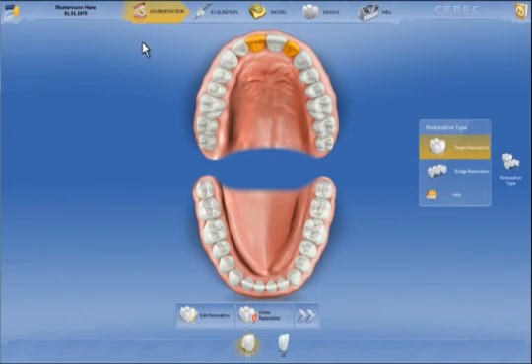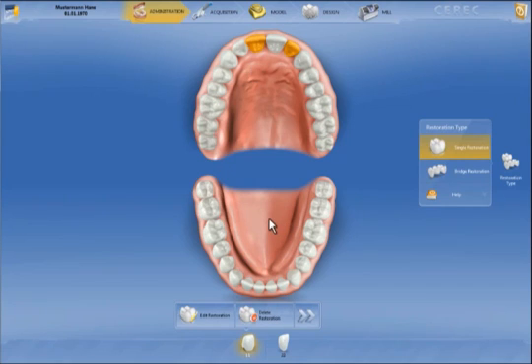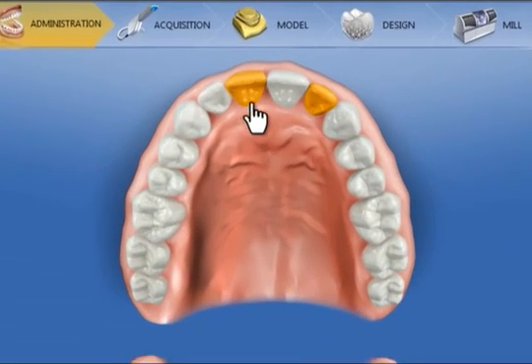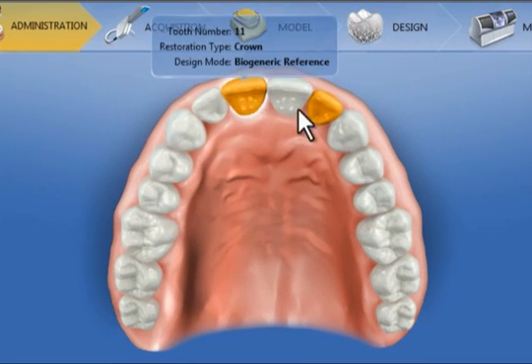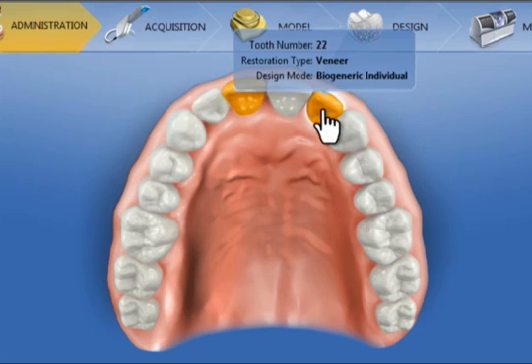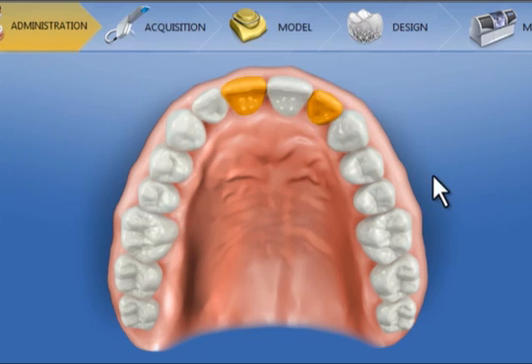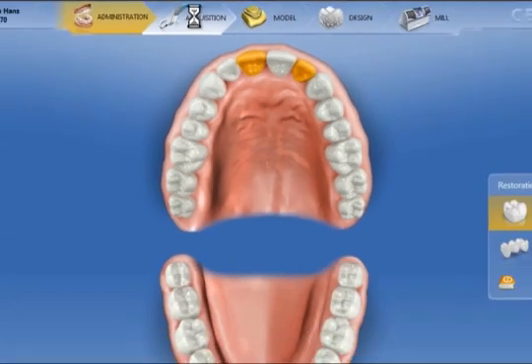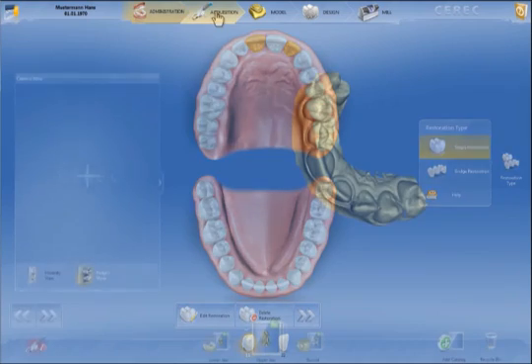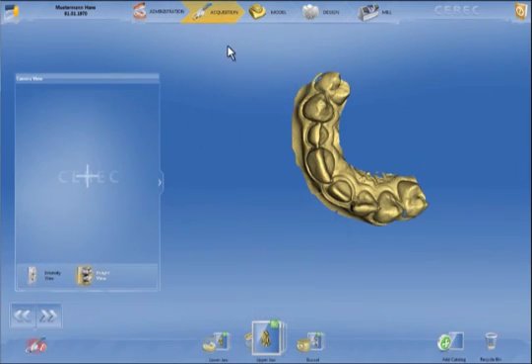The next phase is administration. Here, restorations and restoration types are defined. CIRIC 4.0 permits multiple restorations per case. Following on from the administration phase is acquisition.